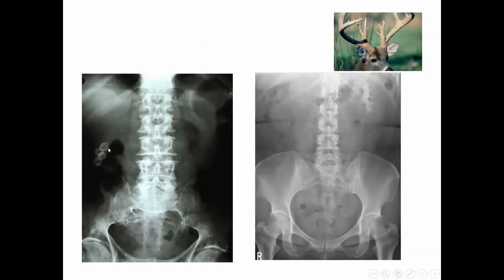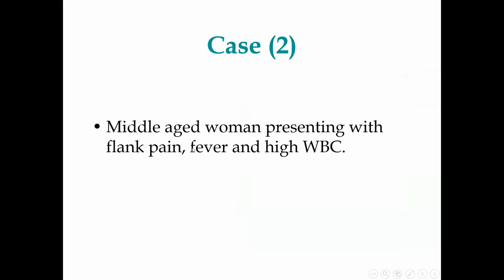Remember, on the right side, sometimes you could think that these are renal stones. Remember, the gallbladder also has stones. And as I've said, although the majority are cholesterol stones and are not radio-opaque, some stones can be opaque if they have some calcium deposition. So this is actually gallstones. So remember, gallstones can mimic renal stones on the right side. But obviously on the left side, if you see calcium, it's going to be renal stones. There's nothing on the left side which can mimic renal stones.